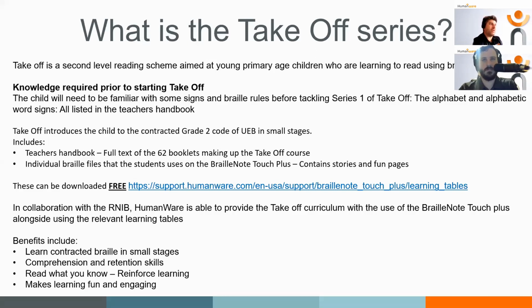Now, this whole curriculum is available free of charge. That's right, free of charge, and it is available to download from HumanWare's website. Now, for the Takeoff series, you'll need to know that some prior knowledge is required. The children will need to be familiar with some of the signs and Braille rules before tackling Series 1 of the Takeoff. They'll need to know the alphabet and alphabetical word signs. All of this is listed in the teacher's handbook.